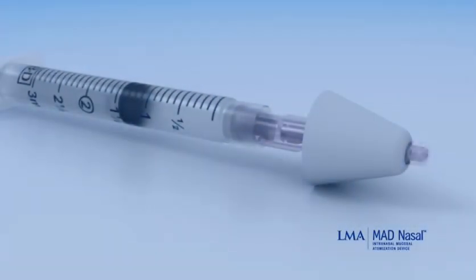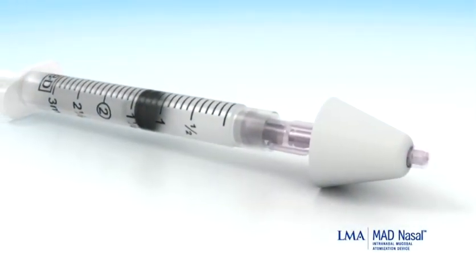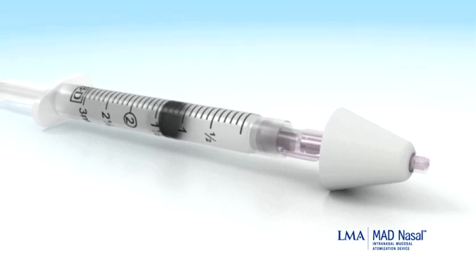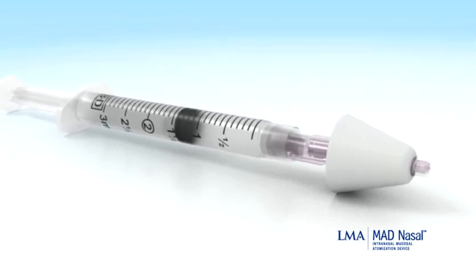The LMA MAD Nasal is the safe and painless way to deliver medications directly into your patient's bloodstream without an intravenous line.